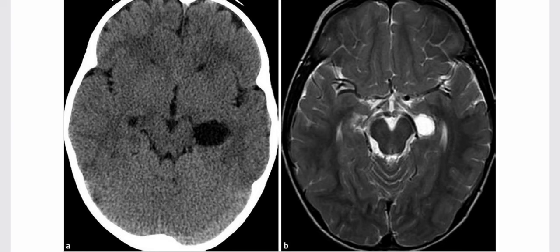Case of a young man presenting with chronic headaches, and these are the images. Now as you can see, on the axial CT scan there is a well circumscribed CSF density mass in the left choroidal fissure. On the axial T2 weighted MRI sequence, at the same level, it reveals similar findings with the lesion in the choroidal fissure, and this lesion is following CSF signal intensity.